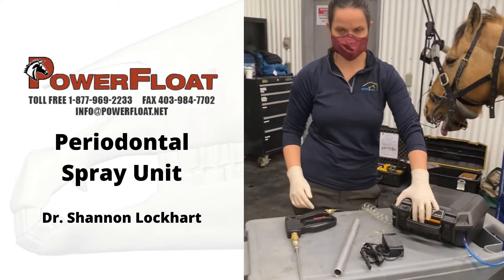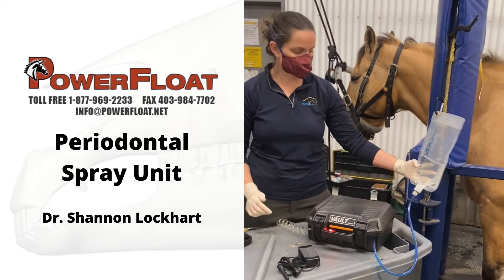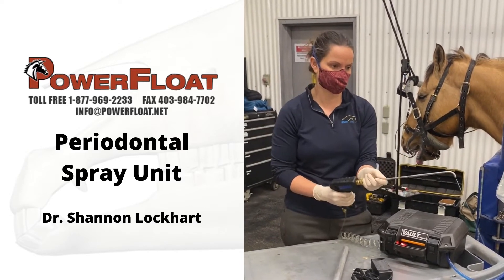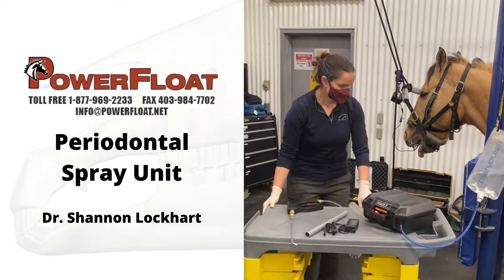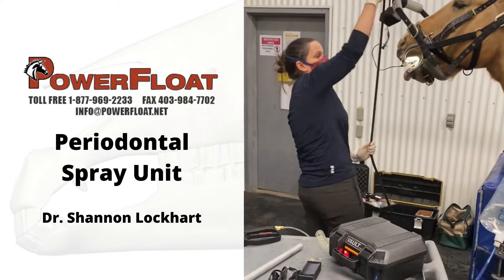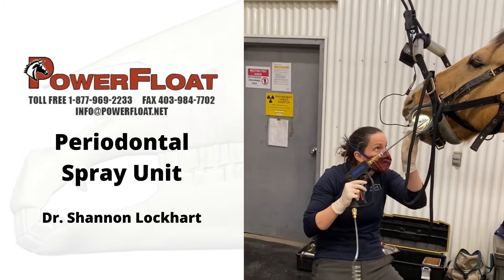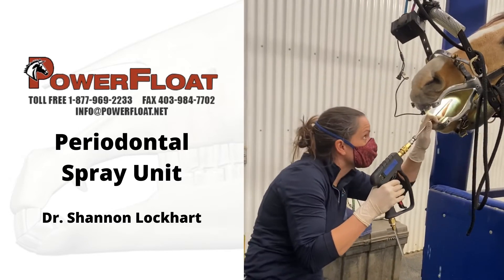This is the on-off switch. The other big thing is you have to make sure you have a water source — it just needs tap water, which is great. Once you have it on, you just need to prime the line and it's ready to go in the horse's mouth. Once you're ready to go, the horse is sedated and ready. It has a coil line so it's nice and flexible — use it in your perio pockets that you're trying to clean out.